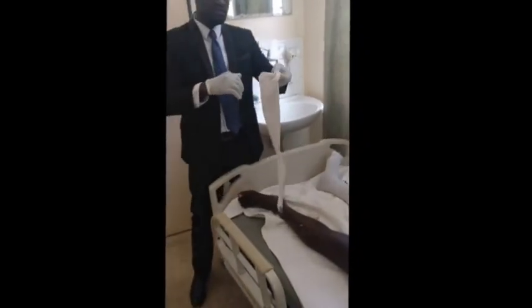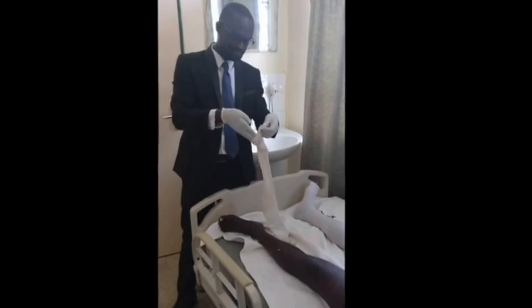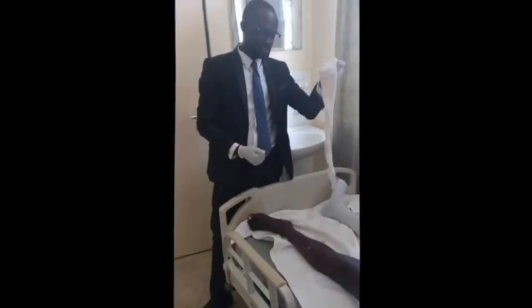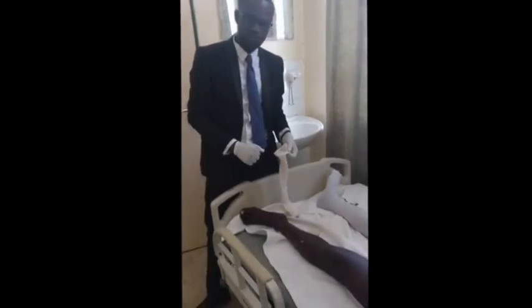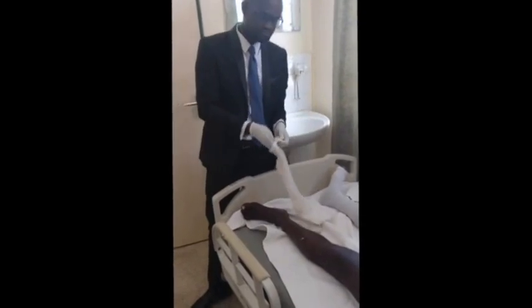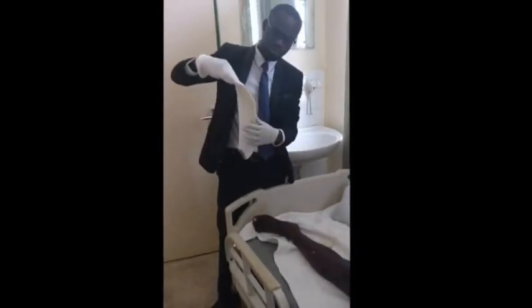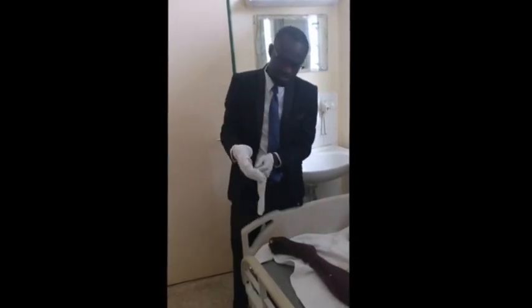Before I fit the stocking, I need to insert my hand into the stocking and reach for the heel pockets. Unfortunately, it's inappropriate for the leg, so we might have a little bit of difficulty putting the stocking on, but we'll still go ahead and fit it. So I put my hand in as far as the heel pockets.